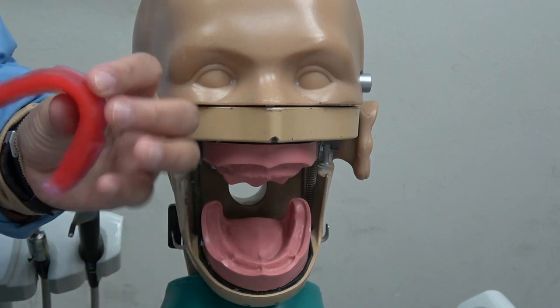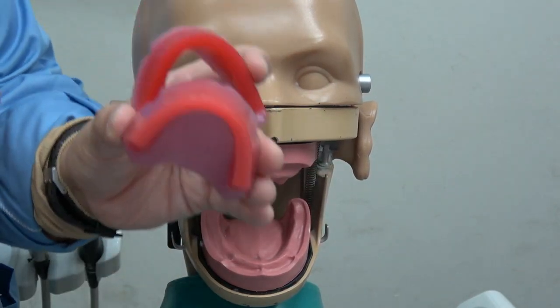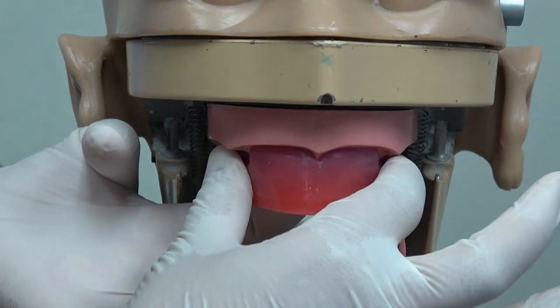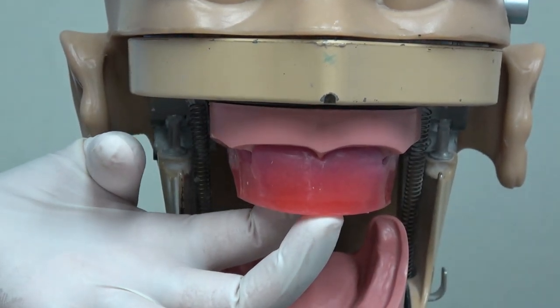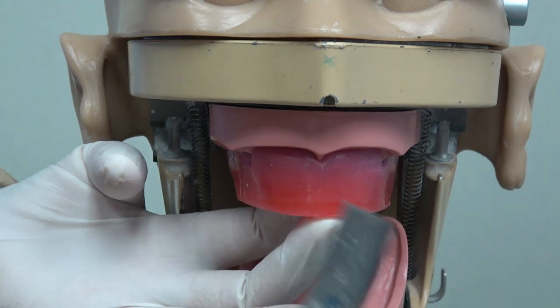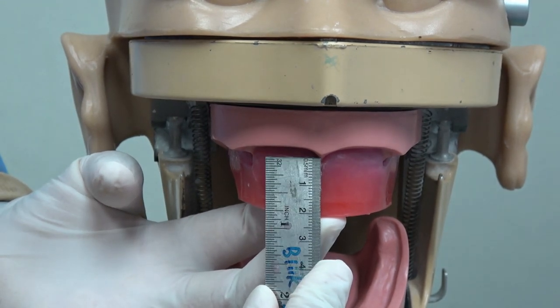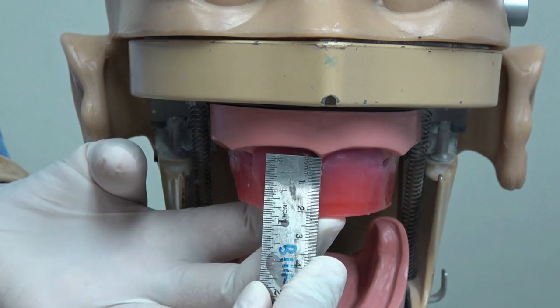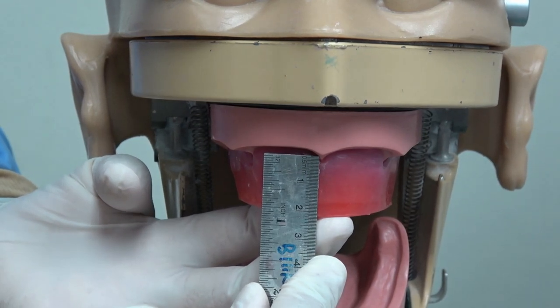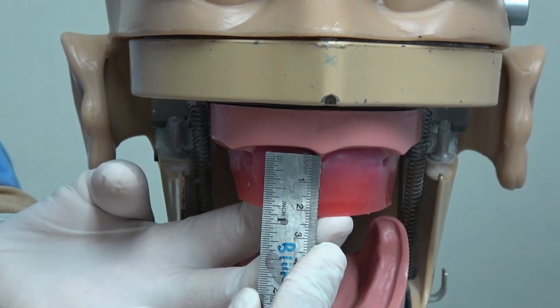So we need this occlusion rim. Make sure your occlusion rim is smooth and shiny, according to your checklist. Place the maxillary arch. Before you check for the parallelism, you must measure your wax rim height, from the frenum to the inferior border. It should be around 20 mm. If your wax is not 20 mm, then you have to trim it off with the scraper. But here it is 20 mm, so I need not adjust anything.